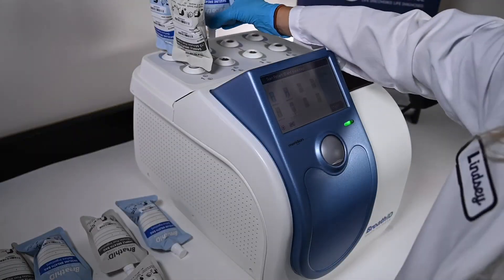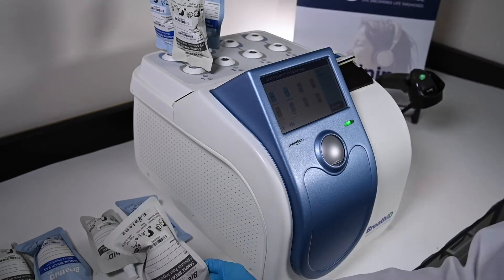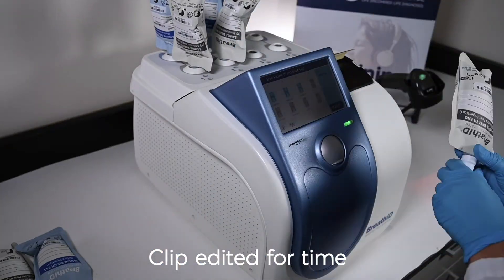The user can continue scanning and placing bags as needed. Up to four pairs can be loaded on the BreathID Smart for analysis. If fewer than four pairs, the instrument will prompt the user to confirm running less than a full batch.